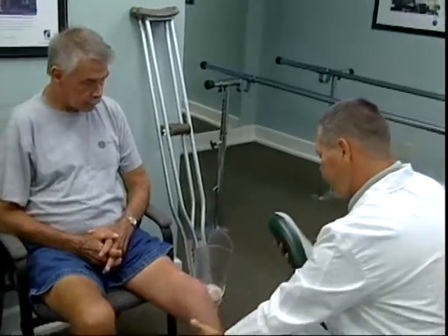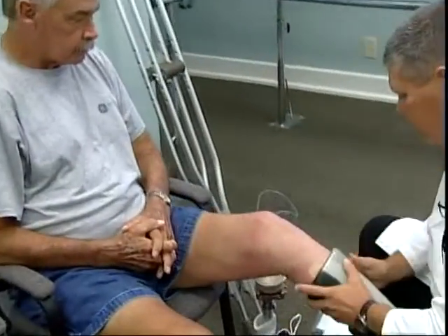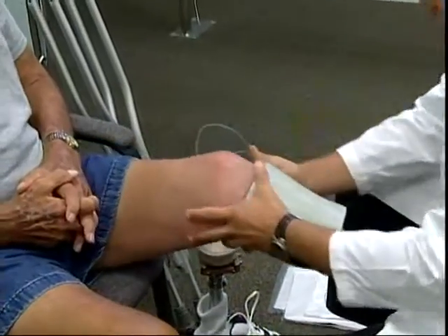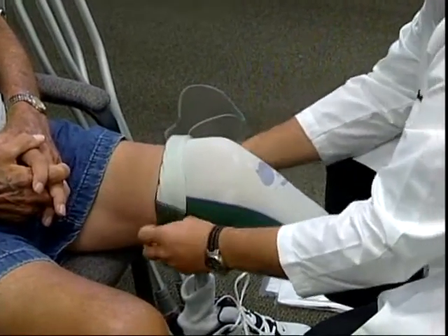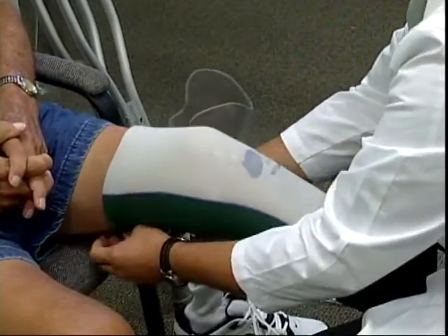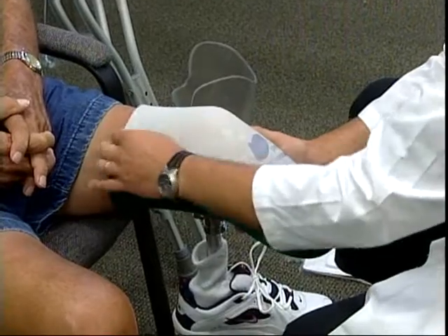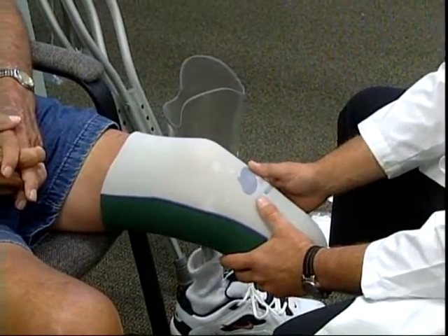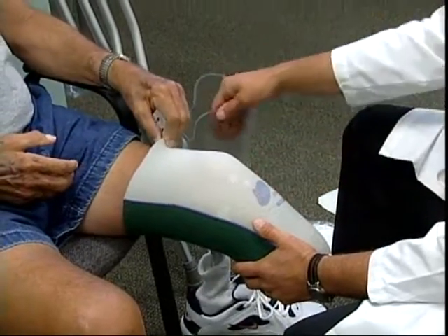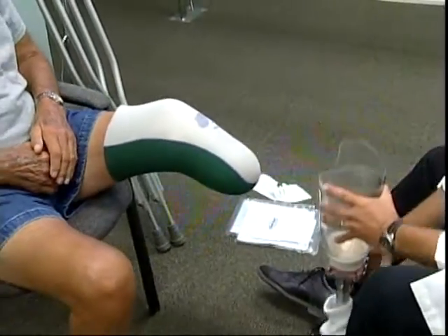So we're going to roll the liner in place. You start right on the end. And that rubber goes next to the leg because it won't slip at all, I guess. That's correct. This creates, it's actually a suction liner. So once this is rolled in place, there's no displacement or movement between the skin and the urethane material. Any displacement, if any does occur, is going to occur between the exterior of the liner and the prosthetic socket. Okay? So at this point, we're going to go into the socket.